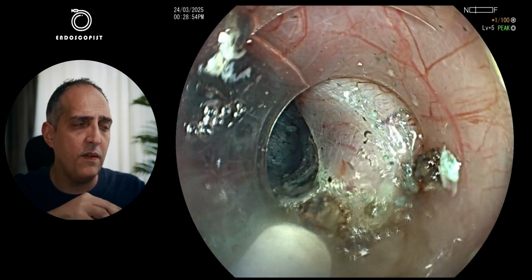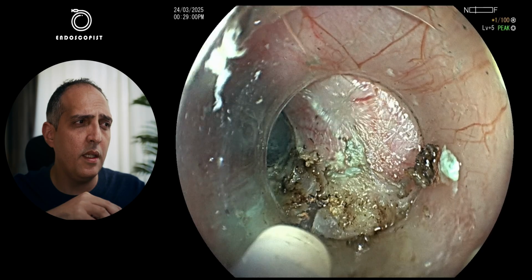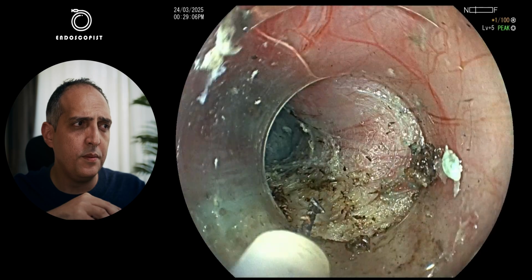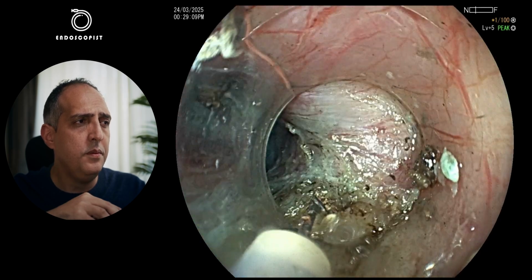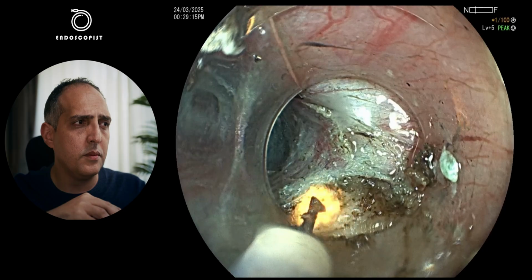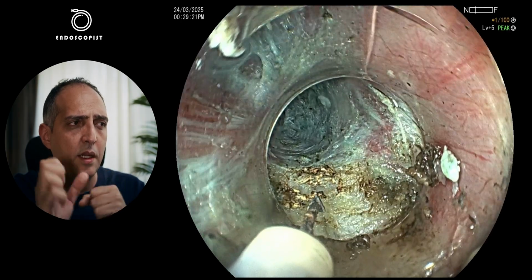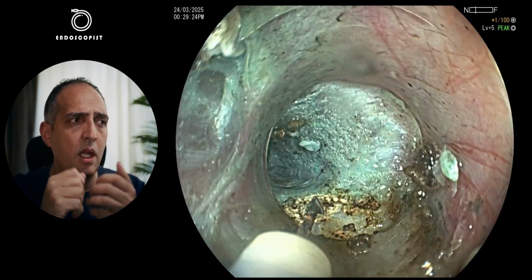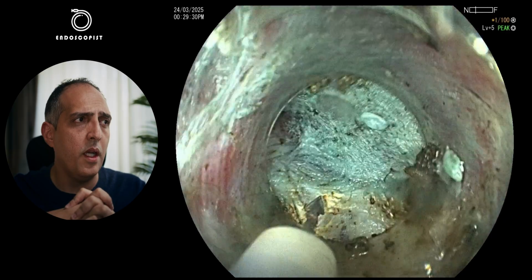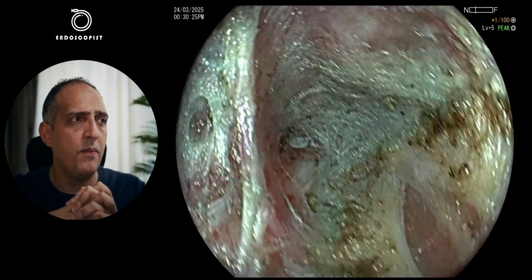Watching, of course, the penetrating vessel, because I don't want to hit it with my knife. Cutting here again, and any circular muscle fiber I see, I will just cut. So again, as you can see here, the whole POEM procedure is a collaboration between mechanical dissection, traction, and the electrosurgical current. So we are going down, reaching our limit right now, with the second penetrating vessel to the left from us. Now I remove the cap.